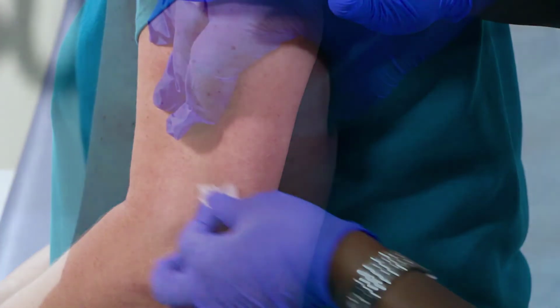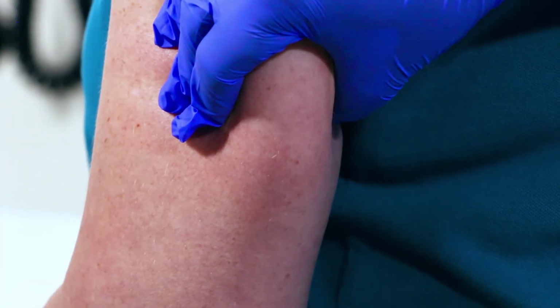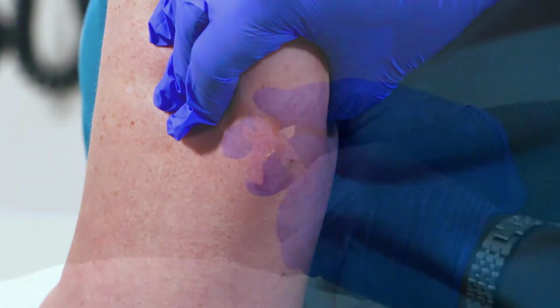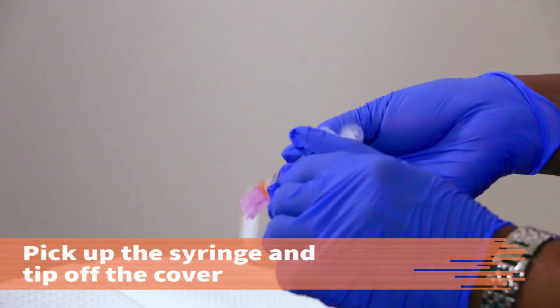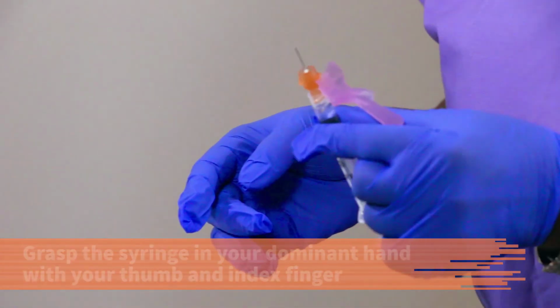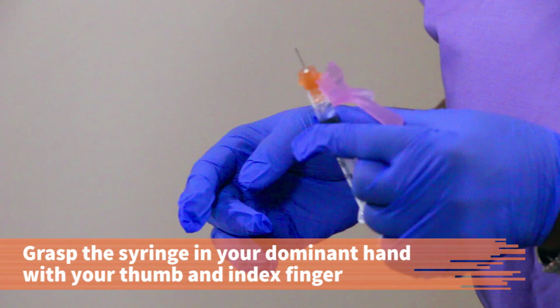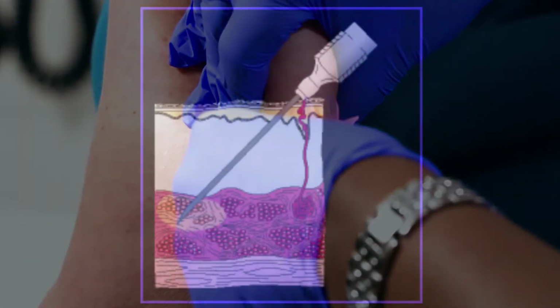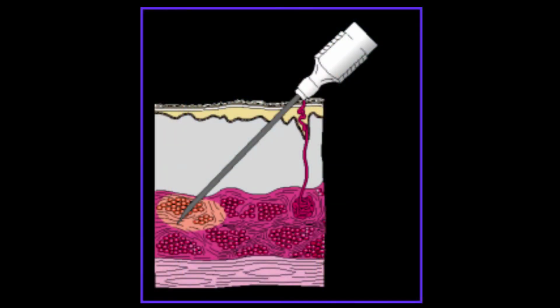Let the site dry. With the index finger and thumb of your non-dominant hand, pinch up the skin at the cleansed area. Pick up the syringe and tip it to remove the cover. Grasp the syringe in your dominant hand. Use your thumb and index finger. Make sure to have no fingers under the syringe. Quickly and smoothly insert the needle into the site using a 45 or 90-degree angle, depending on the needle size.